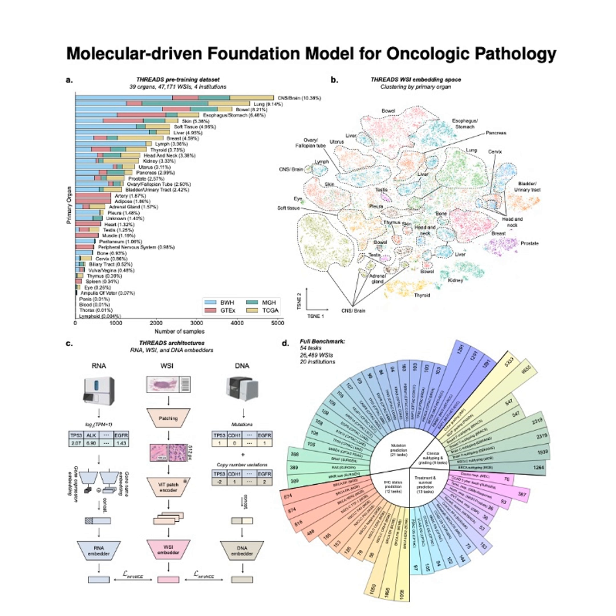Precisely. Now, beyond the standard benchmarks like linear probing or fine-tuning, Threads also introduced some more advanced capabilities that seem potentially revolutionary for clinical workflow, particularly this idea they called molecular prompting. Molecular prompting. Okay, that sounds intriguing. What is it? It's a completely novel way to perform what's called zero-shot classification. Zero shot. Does that mean classifying something the model has literally never seen an example of during its visual training?